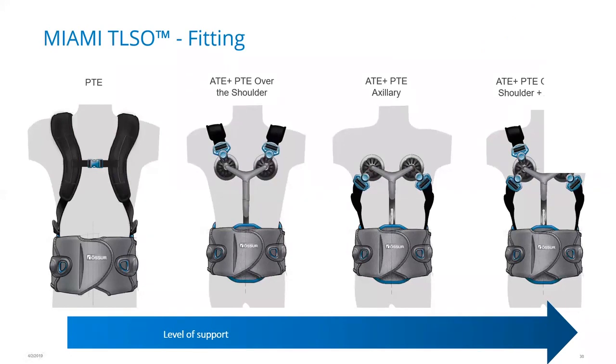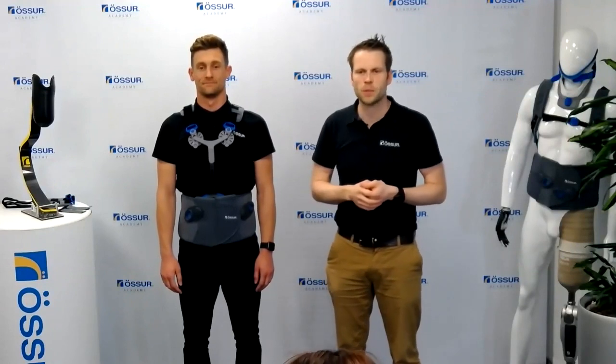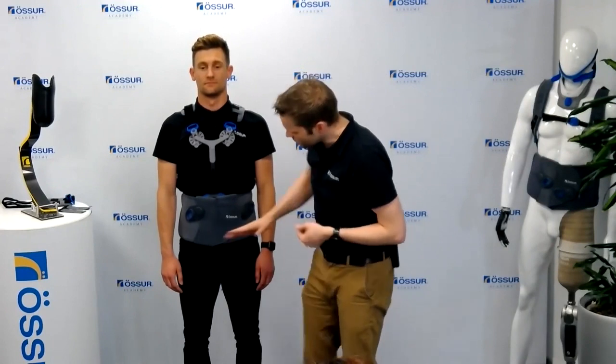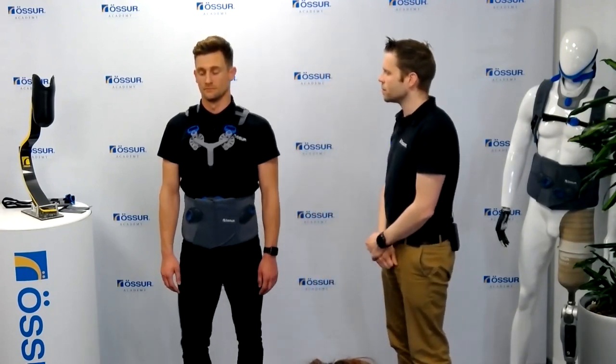Okay, so we've got the ATE, PTE over the shoulder design here, and what we're going to do in a second is swap over to the camera, and I'll show you the different configurations that we've got here. Okay, so if we swap over to the main camera, you can see we've got the ATE plus PTE over the shoulder configuration. Everything's positioned nice and centrally. You can see that it's nice and low, making sure that we're anchoring it over the iliac crest and stabilizing the pelvis. Pete, if you spin round.